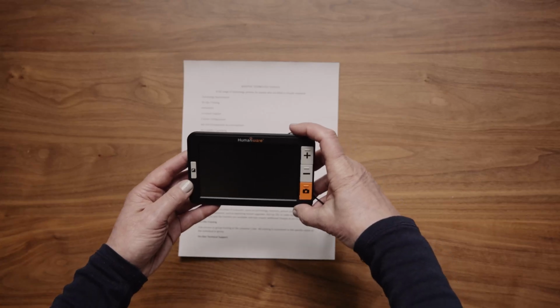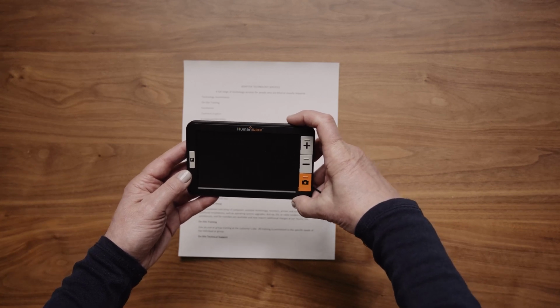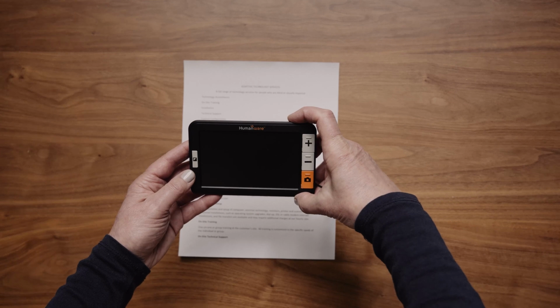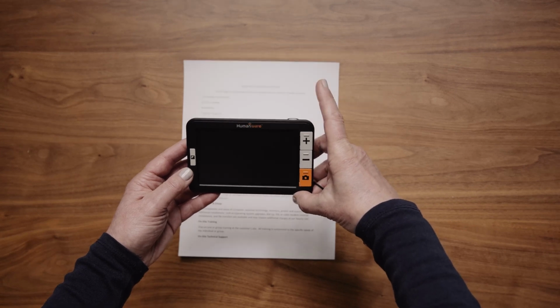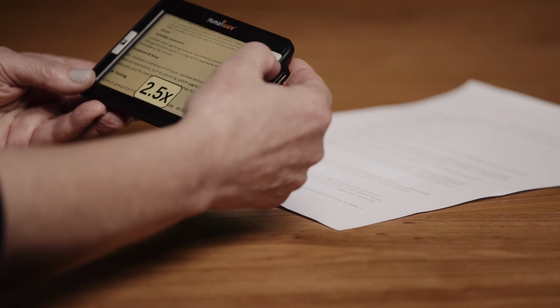Magnifying Mode. This is the Explore 5's primary mode of operation. Point the device at what you want to see and adjust the magnification and contrast to your needs.